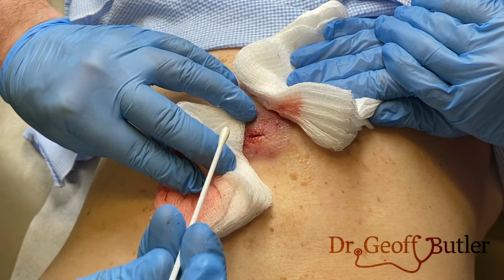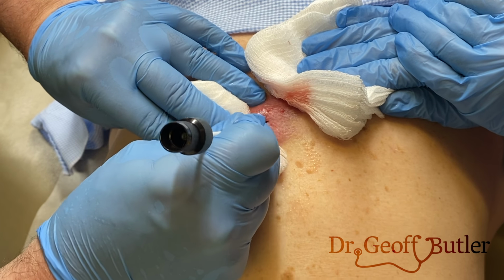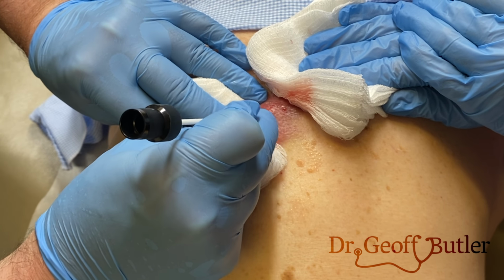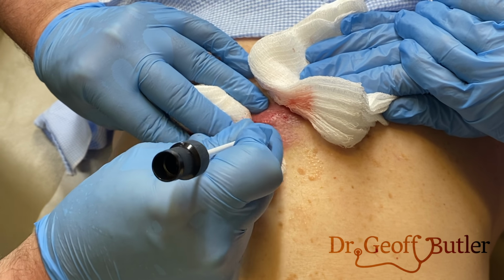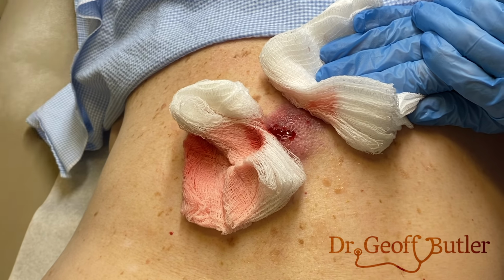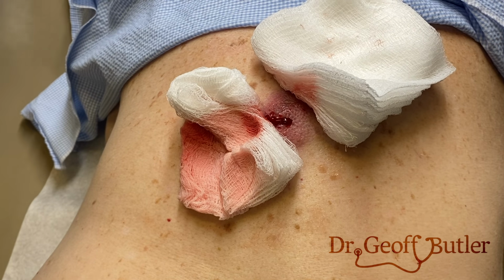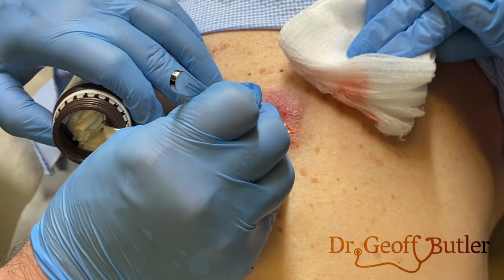See, now it's at this stage that I'll actually do a swab for microbiology. So here we want to just scrape the wall here. And again, I always tell residents, it's like if you were trying to interrogate a soldier. You certainly wouldn't interrogate a dead soldier. You want to find somebody who's alive and then interrogate them, and that's what microbiology is like. So we're hoping that we find a live bacteria along the side of the wall, and we'll send that off. That's about it.